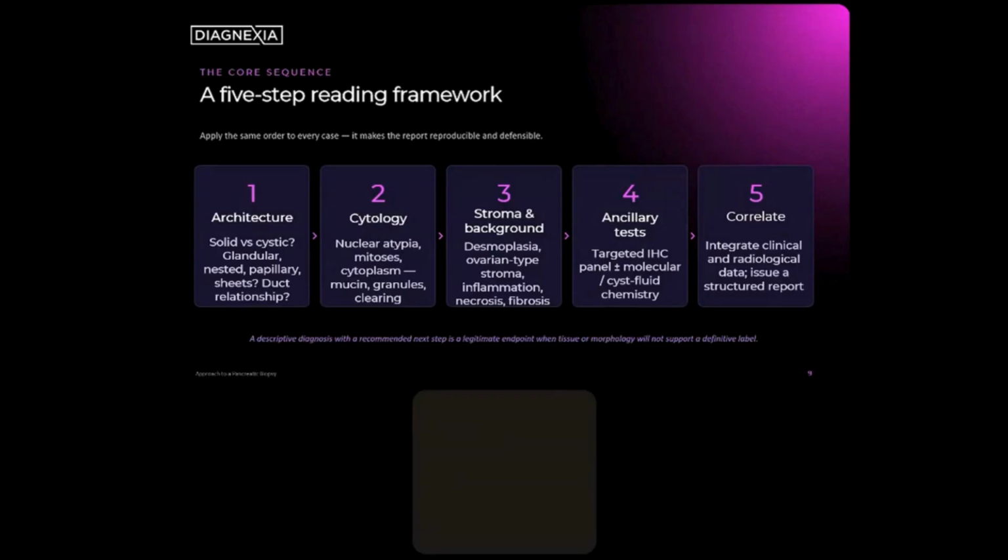So I advocate 5 basic steps in approaching pancreatic biopsy, and you just apply it uniformly, and as I said, it allows for reproducibility. You can defend it because you've gone through all the possible parameters, and of course, it prevents error, and I think that's, at the end of the day, what we want to do, which is to do no harm.